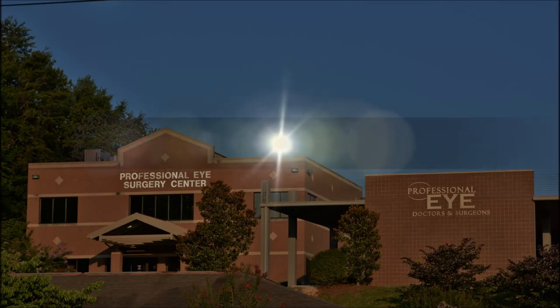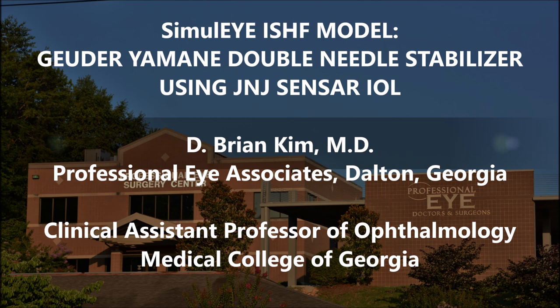Hi, this is Brian Kim. I'm going to share with you this Simuli intrascleral haptic fixation model eye case using the Guter Yamani double needle stabilizer with the J&J Sensar IOL.